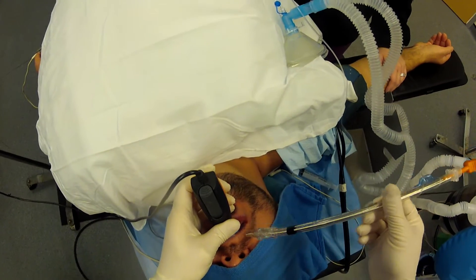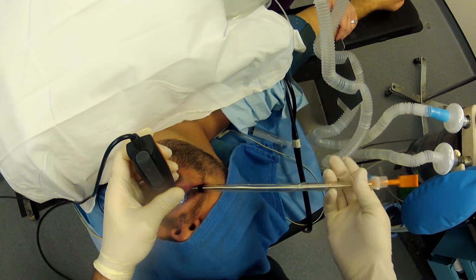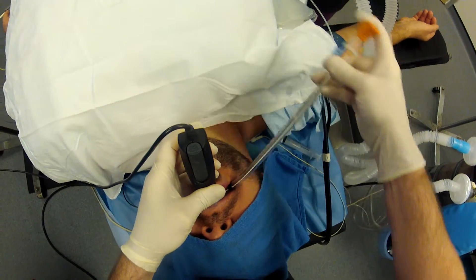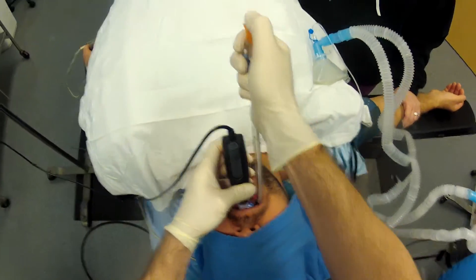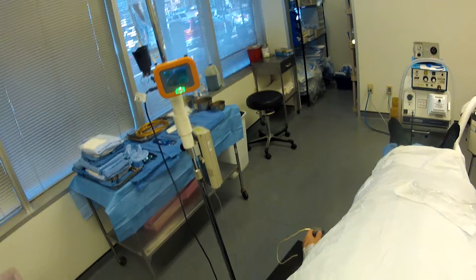Insert the lubricated endotracheal tube at a right angle to the patient's head, medial to the back molar. We're going to swing our endotracheal tube around and do our slot machine, aim directly towards the cords.